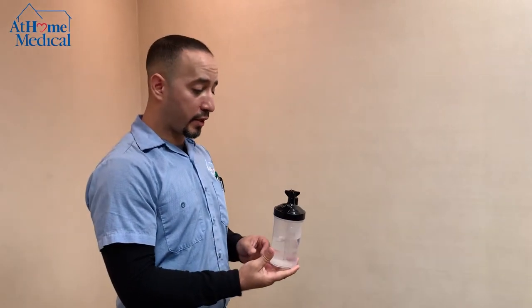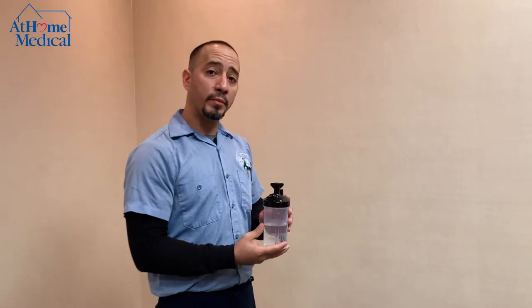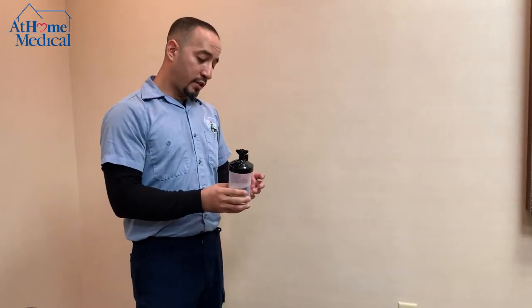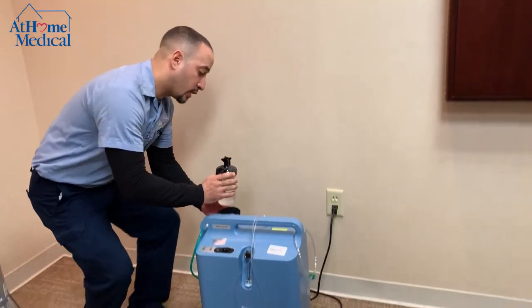I will show you how to use a humidifier bottle. You would only use this if it was prescribed by your doctor. It basically helps moisten the oxygen, as a lot of patients get dryness in their nasal passage.